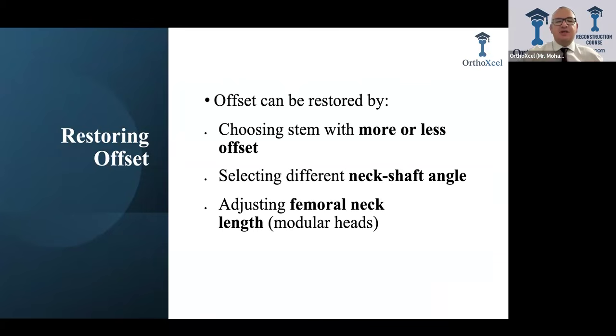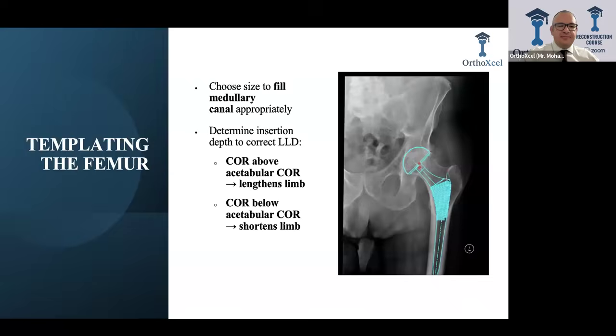It's different from using cemented to uncemented stems. The uncemented stem has a lot of modular necks, where you can change the proximal part into a high offset, into a varus, a lot of options like KA, KH, different options according to the different implant. You have this option on the cemented side with modulation or neck adjustment.